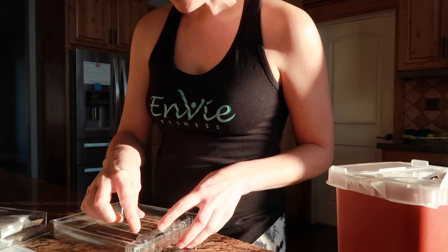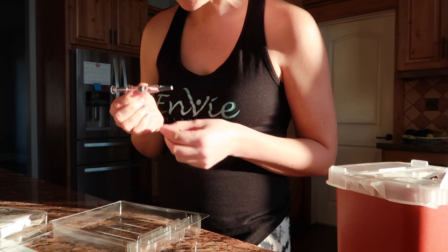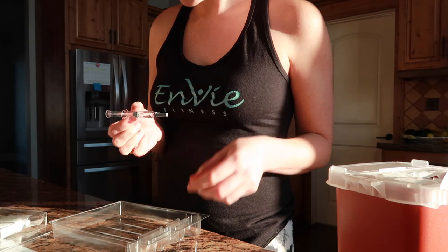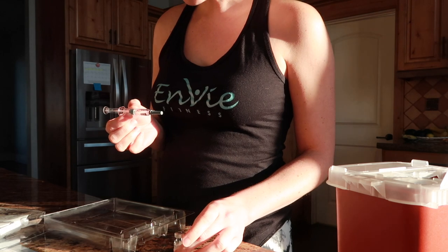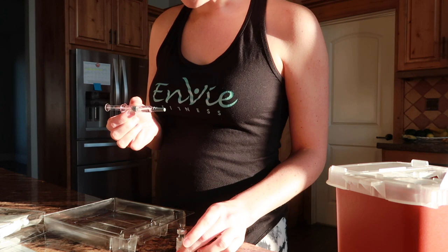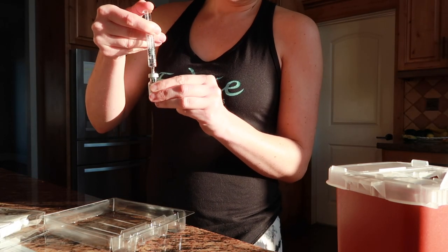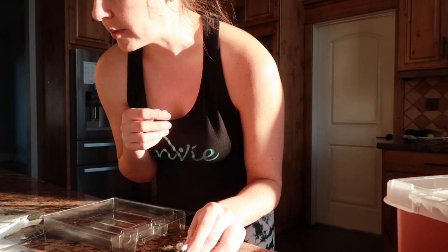Carefully pull the tab off of the pre-filled syringe of bacteriostatic water — do not touch the needle or allow it to touch any surface. Position the needle in a straight upright position over the marked center of the rubber stopper on the vial. Insert the needle through the center circle while keeping it straight. Slowly inject the water into the vial by pressing the syringe plunger. Do not shake.